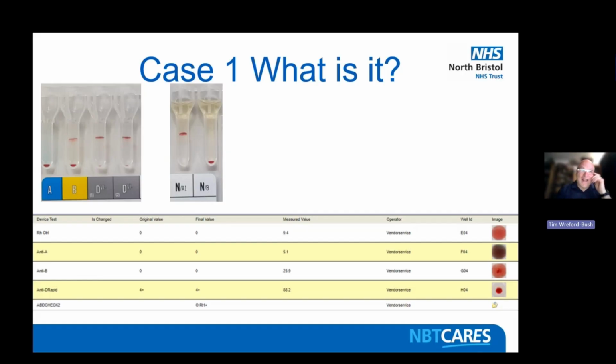Right, so what we see here is we've got mixed field. What's interesting, though, in the anti-B, you can see you've got plenty at the top, in anti-D, you've got some at the top, and you can see a little bit at the bottom. But you can see a lot more in the B. Look at the reverse group.